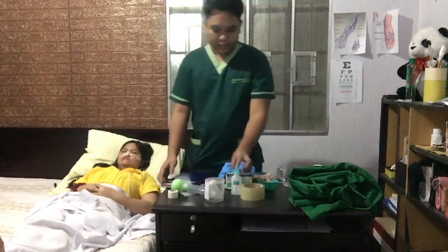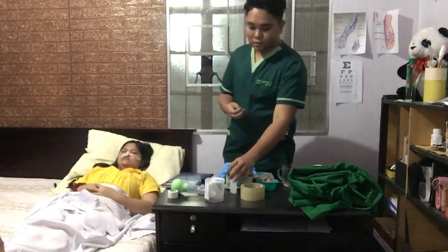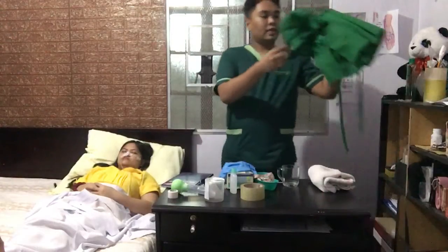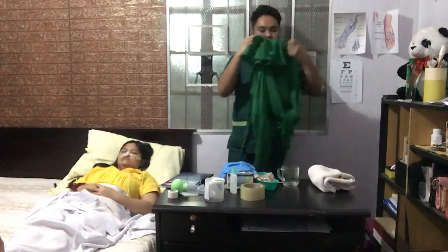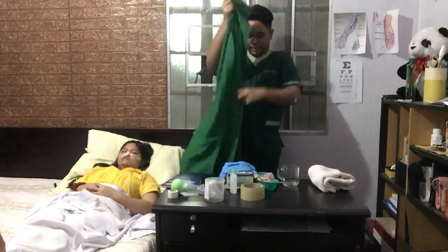Then, second one po is magpe-perform po tayo ng hand hygiene. And observe po yung infection control procedure. And then, magsusuot tayo ng PPE to protect ourselves and to prevent the spread of the microorganism.